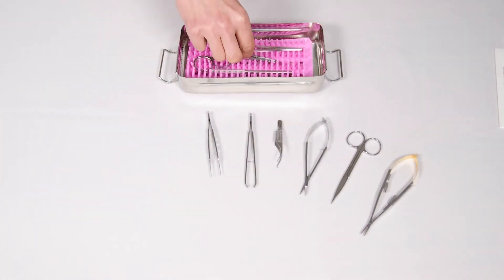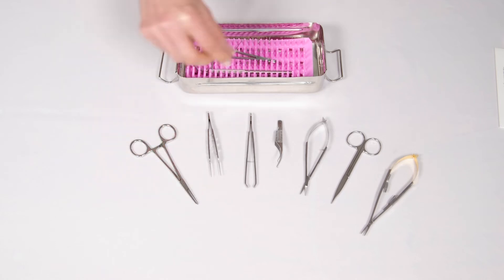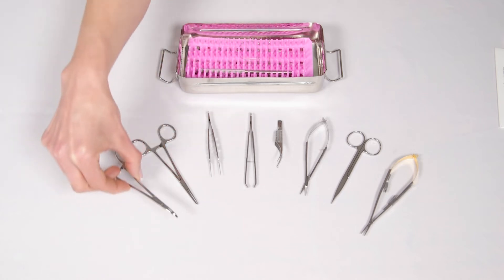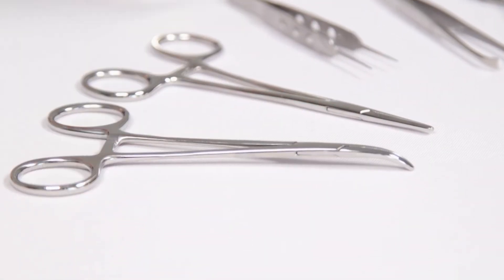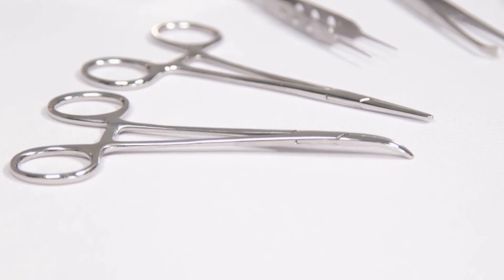Two Holstead mosquito forceps are also included, one straight and one curved. The small size of these haemostats make them suitable for delicate surgery.